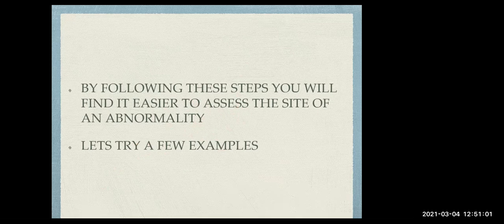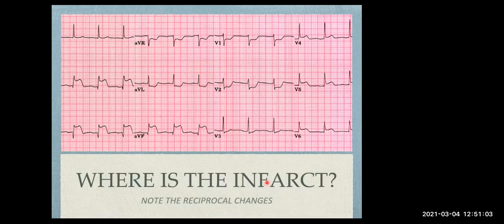So let's try a few examples and let's see. So let's start first. So if you want to challenge yourself, you can pause it now, go through the entire ECG on your own, and you can see if the answers that you got were correct. Okay, and let's take it from there. So let's start first. So we've got lead 1 and lead AVF.